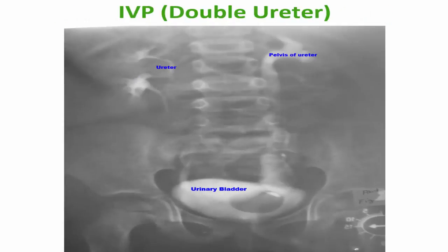Also again, intravenous pyelography showing a double ureter on the right side — this is an abnormality. This is the ureter on the left side, and this is the urinary bladder.